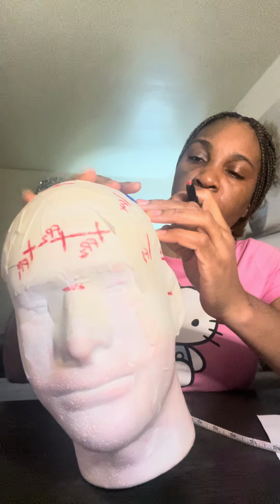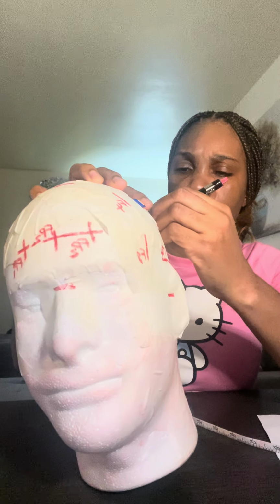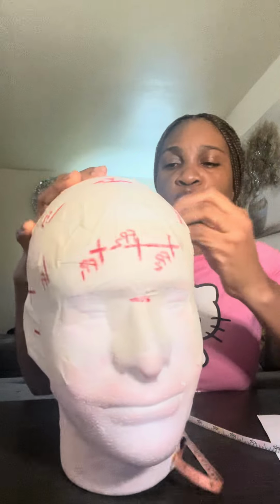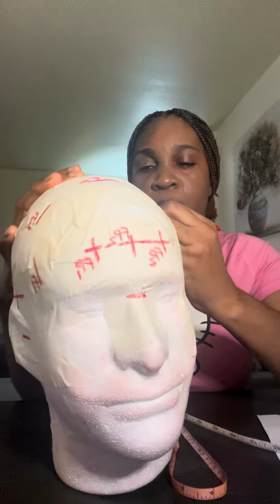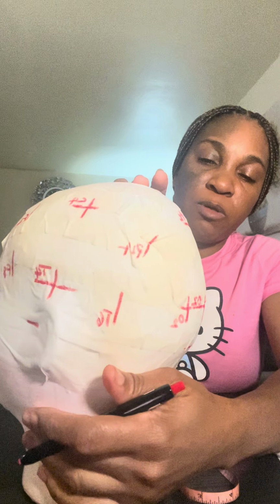This is going to be my P4. Okay, that's my P4. So now I'm done with my parasagittal.